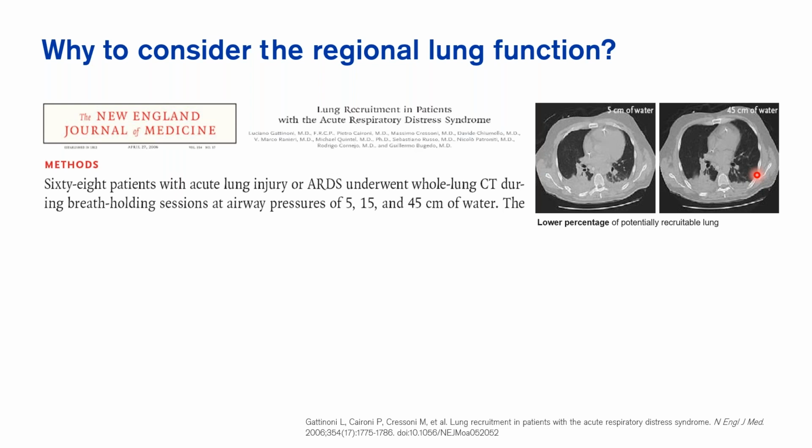And finally, this, I think, iconic publication from Luciano Gattinoni as well compared 68 patients with acute respiratory distress syndrome. They underwent a whole lung CT during breath-holding sessions at airway pressures of 5, 15, and 45 centimeters of water. So basically, they were doing a CT scan during a potential recruitment maneuver.